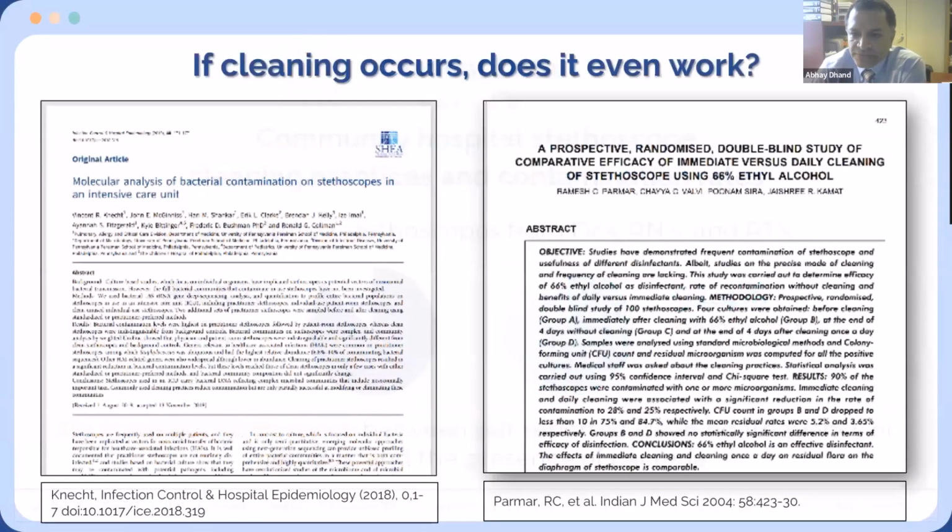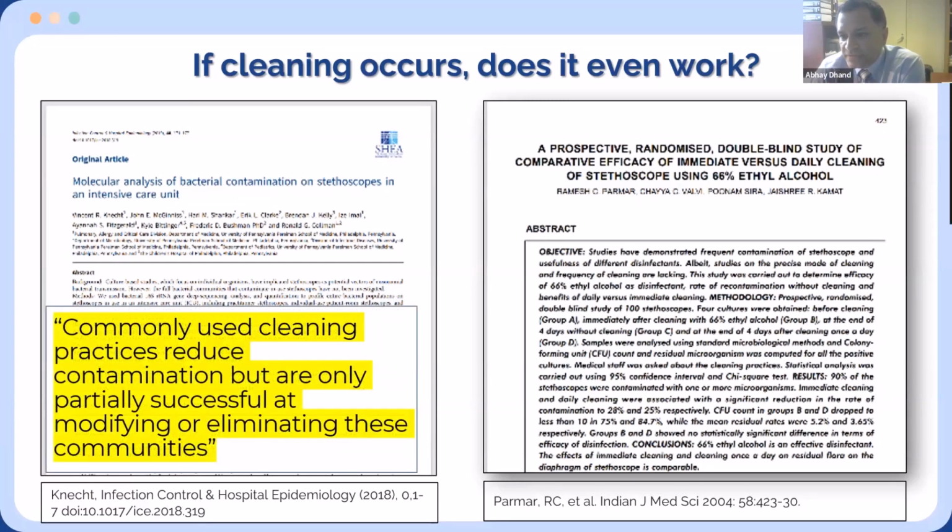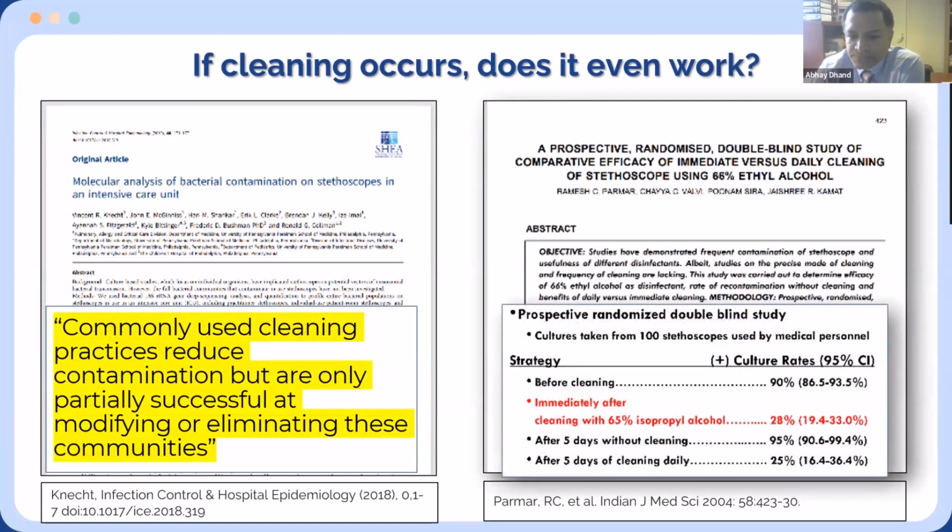The next question is, what happens if the cleaning occurs? Does it even work? So in these two slides, what was shown was cultures done of the stethoscopes of different things to see how many organisms are present. And then, next slide, please. That's the next one. And then what you want to see is what happens when you clean these stethoscopes. Next one, please. So this is the summary of these two studies.